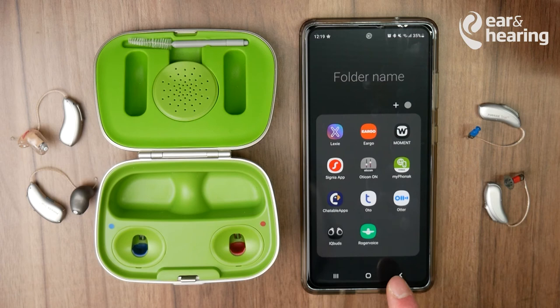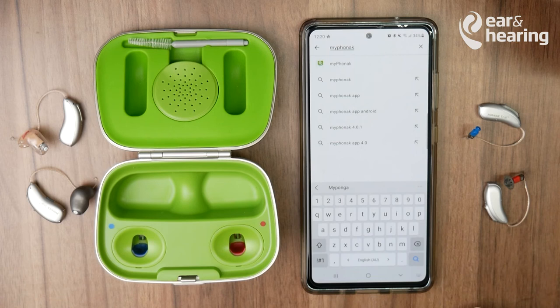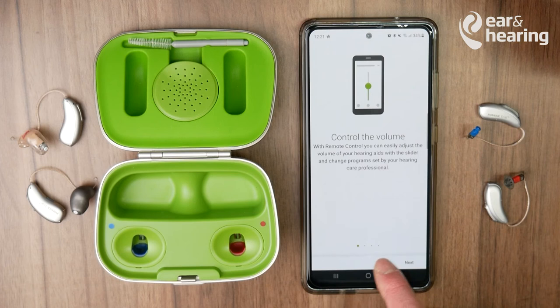If you haven't downloaded the app yet, go into the Google Play Store and search for the My Phonak app — spelled M-Y-P-H-O-N-A-K. Press Install, and once it's installed, press Open and allow it to make phone calls.